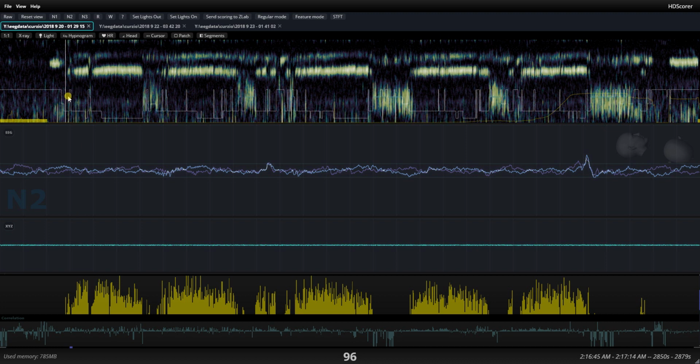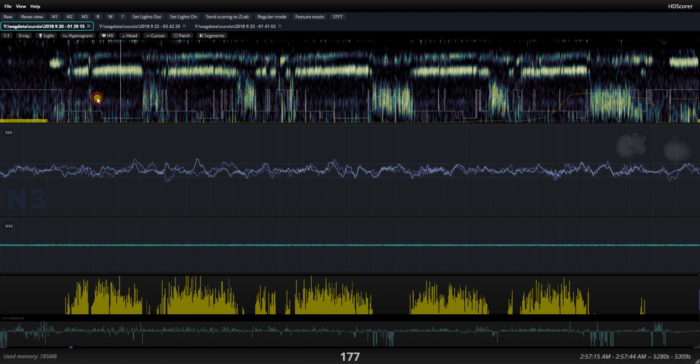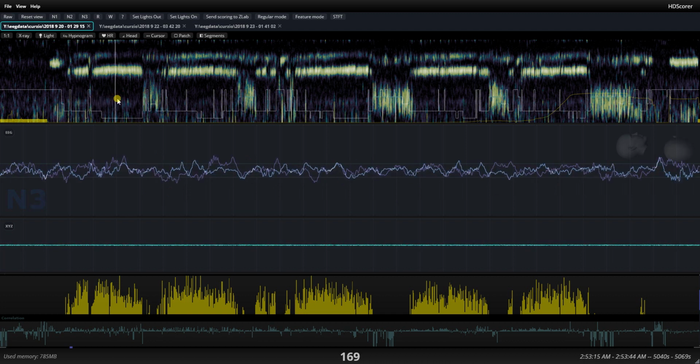The next thing that I would check is N2 and N3. So what this is telling me is that up to this point, I'm in N2 sleep with a couple of interruptions, after which I go to N3 sleep. So what I want to see is scroll there and check what the waveform looks like, and then scroll here and make sure that there is a substantial difference. So now this is the first thing that I wanted to discuss, the N2 versus N3 determination.